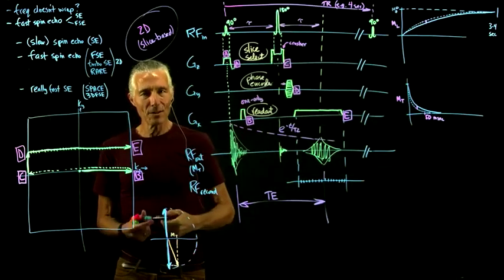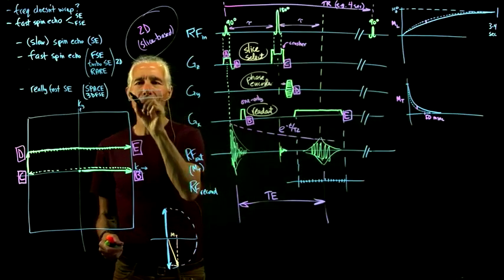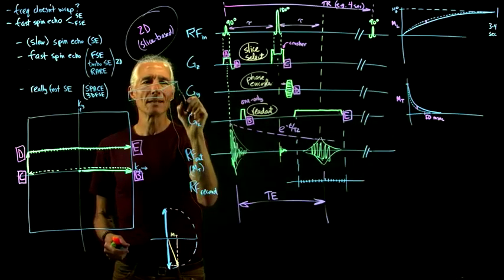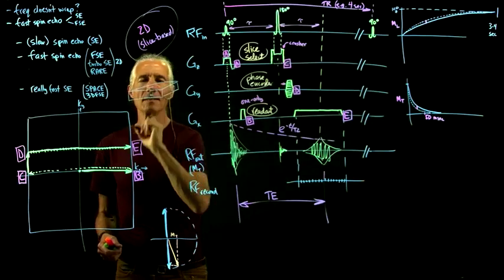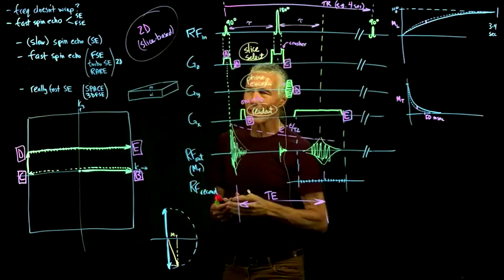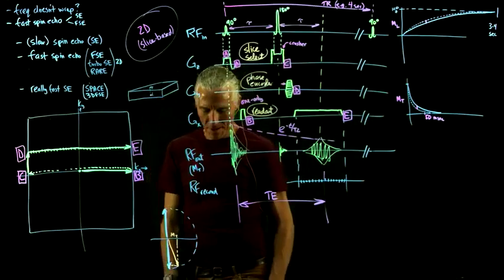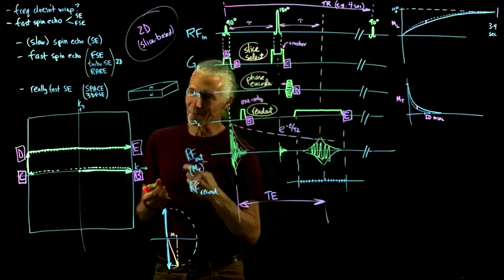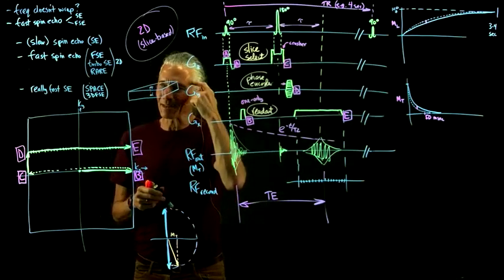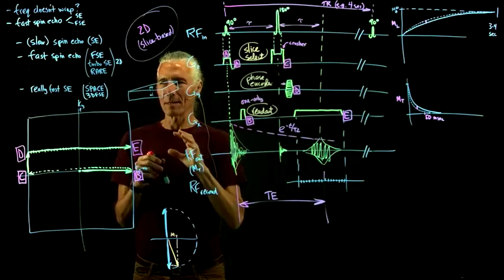But radiologists still like to use these, and one reason is that these slices will be a thick slice, like a 5 millimeter thick slice, but it will have these small voxels in it that extend throughout the slice. And why would you want to look at a slice like that? The reason is that if you're a radiologist looking for something in the brain, you don't want to get confused by all these little thingies, because everybody's brain has little thingies. You've got like a little hole here, a tiny little micro stroke that occurred when you fell off the skateboard and slammed into the ground.